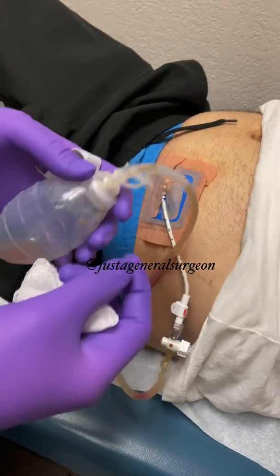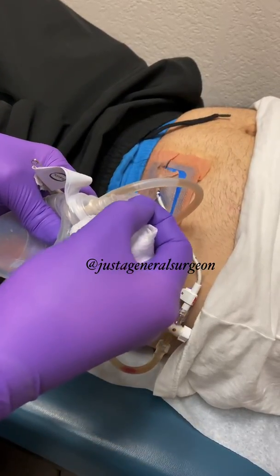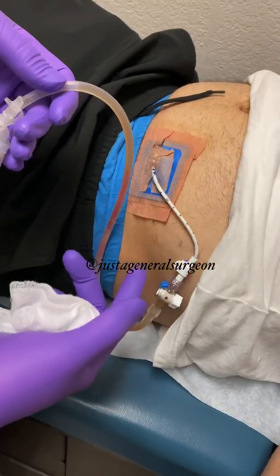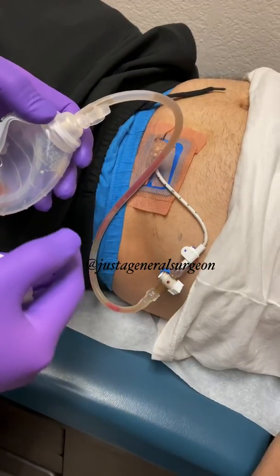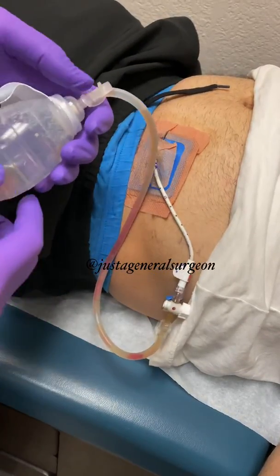This is allowing air to go into the bulb. The way it works is that you collapse the bulb and close the system — it creates a negative pressure vacuum, which draws up fluid from wherever the drain is inserted and collects it in the bulb. So obviously you don't want it sucking on anything as you remove it. Close it back up so you don't spill everything.